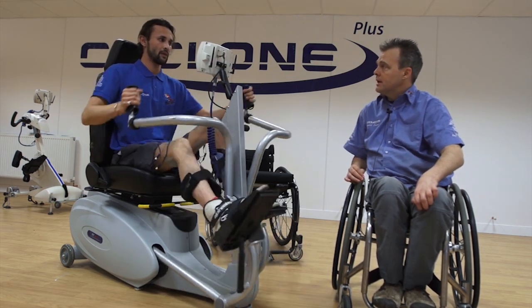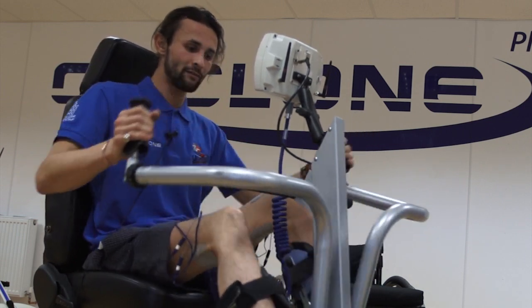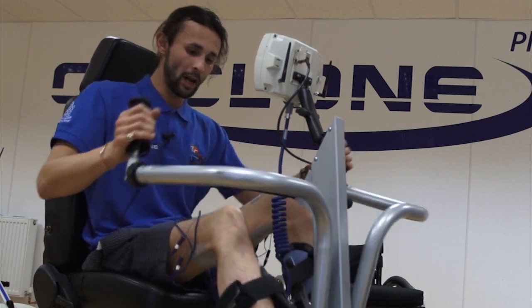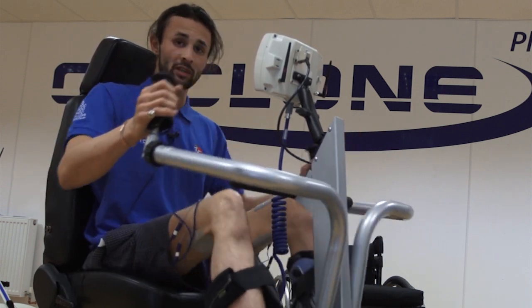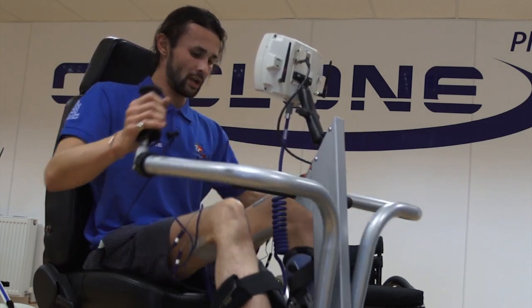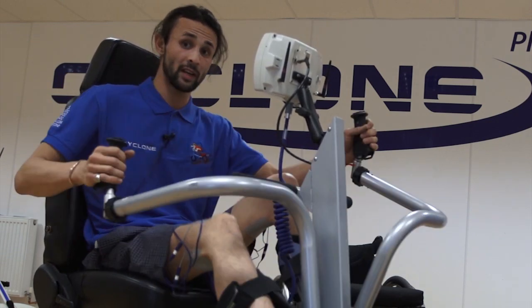We're going to ask him now to start pedaling with his arms. I broke my back at T9, which means I have no sensation whatsoever below my belly button. Ordinarily I would never be able to exercise my legs, and what this enables me to do is give myself a full cardiovascular workout. With your quads being the largest muscle in your body, it helps build and renew muscle around the rest of my body because it releases the right chemicals. It's a fantastic workout.